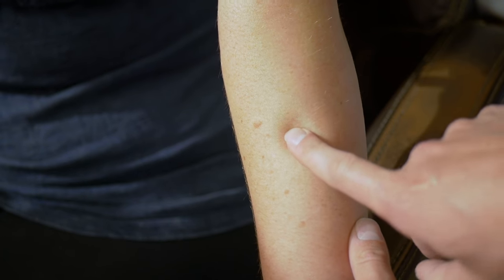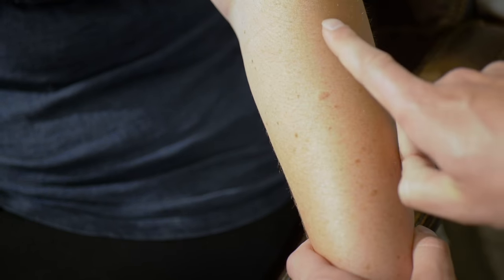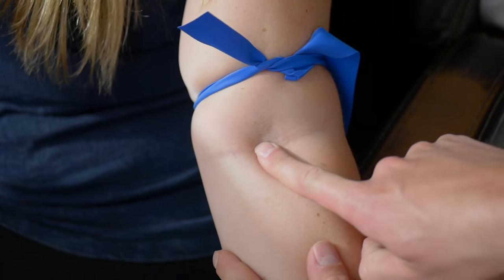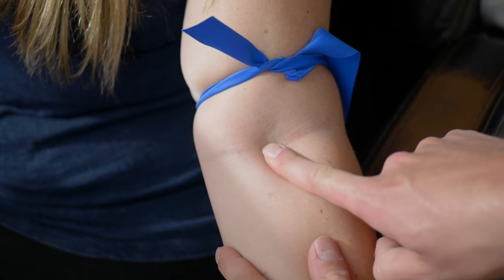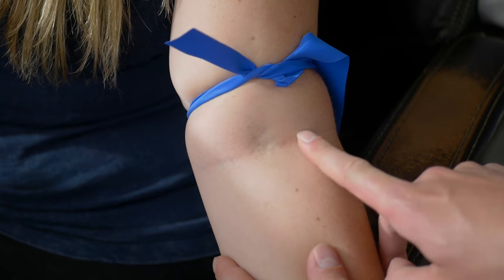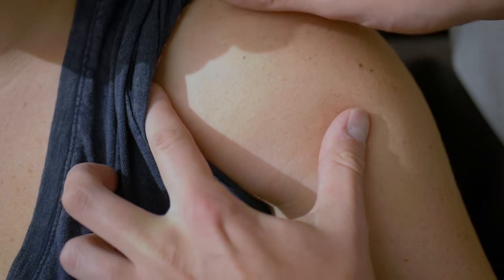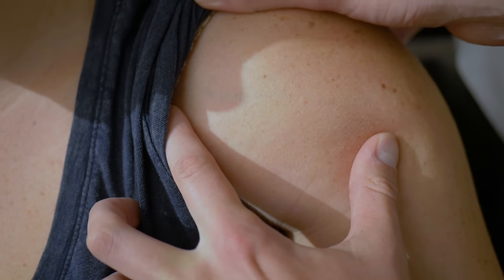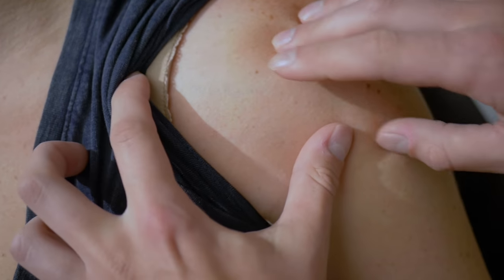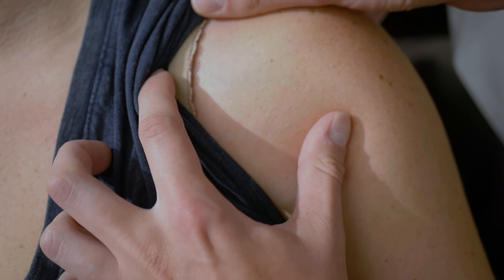On the back of the forearm you typically have a couple of options, and sometimes these veins will be a little more superficial. For the AC area specifically, if you can't see it or it's not bulging out, locate it and use your finger to move side to side to feel the vein if it's deep. Another option to consider if you can't see much else is up on the shoulder area — sometimes there's a pretty superficial vein there. These will probably only take a small catheter like a 22.